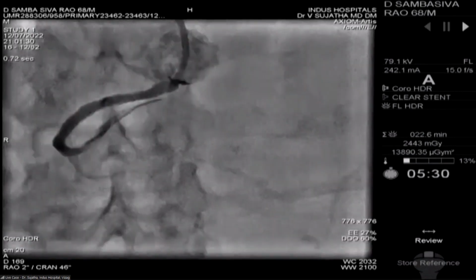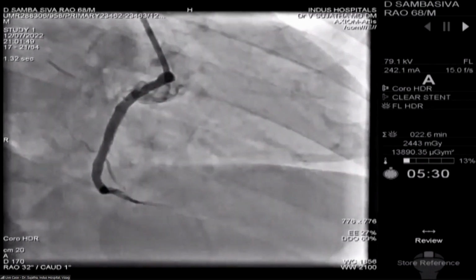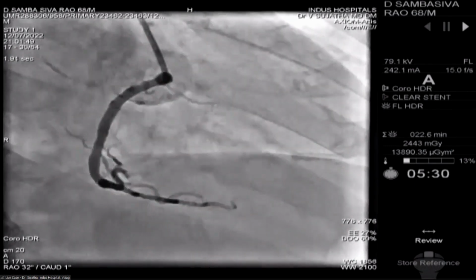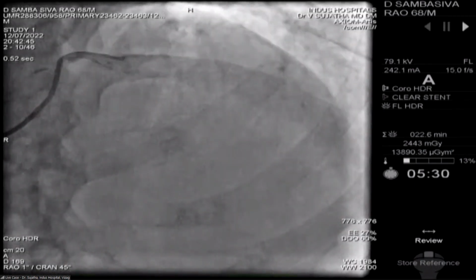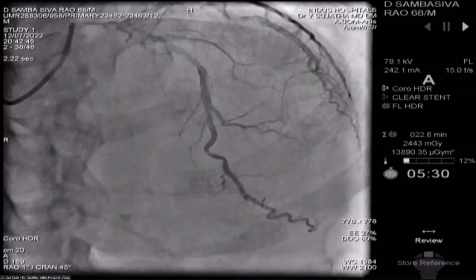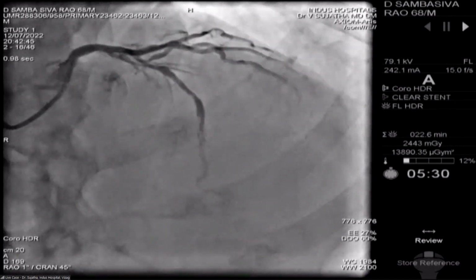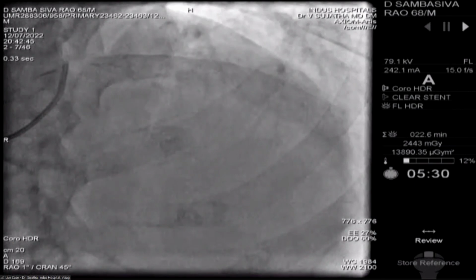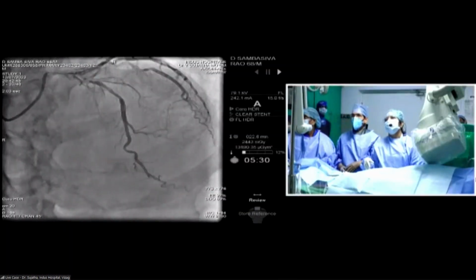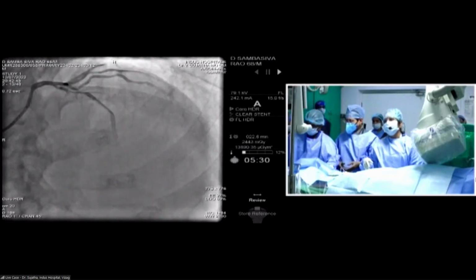So come to the next, come to the angiogram. Come to the LAD. Next. Okay. So you can see there is calcification in the LAD, ostioproximal LAD. We know that we have to do complete revascularization. We are stuck at this stage because we already completed the right. So what do we do with the OMs? What do we do with the LAD? Should we implant the stent from the left main to the LAD? These are the questions before us.